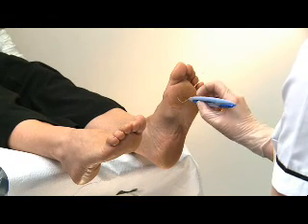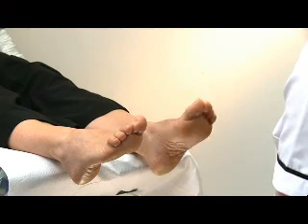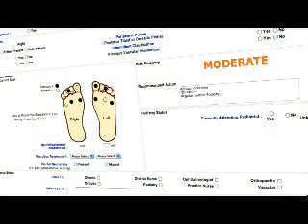The sites and timings should be randomised to prevent the patient guessing. The patient is at risk if they score less than 8 out of the total 10 sites.